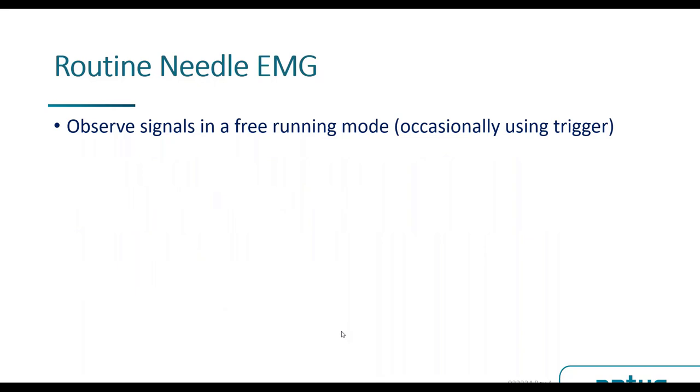We listen to the sound. That's a very important part. And by the way, today you may not hear the sound on some of the videos when I play the EMG signals because I have reduced their intensity. I will be talking over the sound and the two things don't mix pretty well. So if you don't hear the sound of the EMG, don't worry about it.